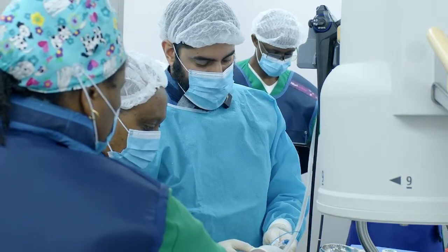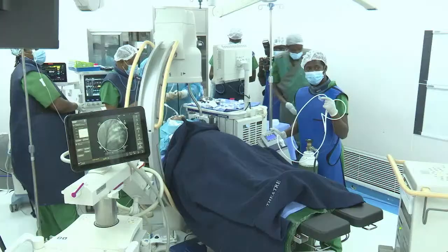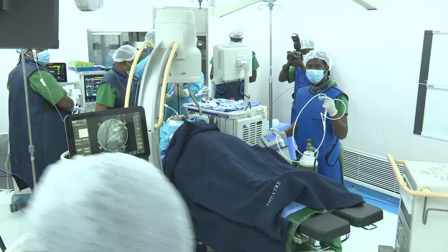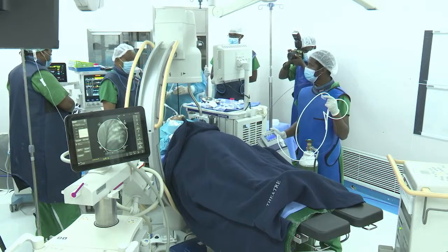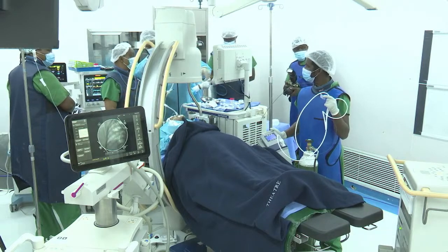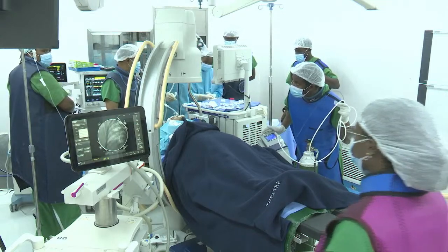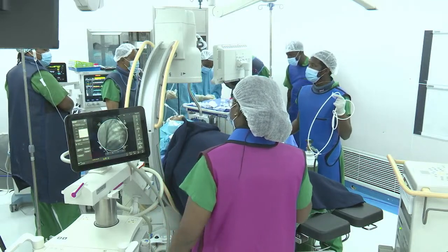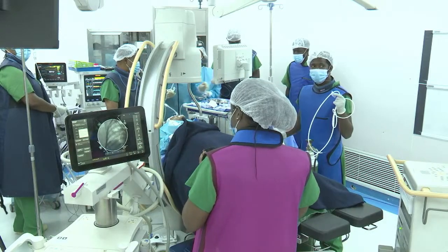I can cover that one. You remove it because you are going to move it anyway. I have ballooned it down there. That's okay, I've opened it now. It can stay in place because you're going to take another sample. Do you take the same segment or move to another? Let's try a different one, the lower segment. Yeah, that's okay. You can see our pieces. They're not bad. We're going to take a couple more. When they come, I need some drugs.